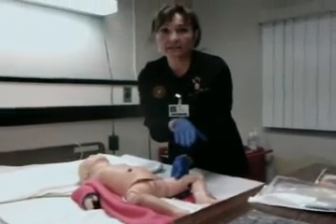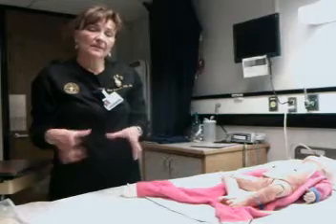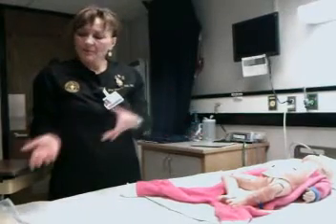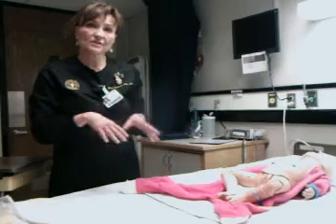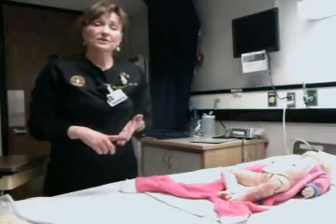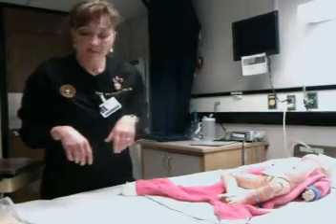Normally with little infants you may have to separate the labia to see the meatus. On the mannequin you can see everything clearly. Now we're going to show you the sterile supplies. The catheter kit comes with a procedure that mentions you can don non-sterile gloves and cleanse the labia, but if you're using the povidine iodine inside the sterile kit you're touching everything. We feel the best method is to wash the labia with warm soapy water and dry first, then come back in with your sterile field. You also need a gown or cover for protection and protective eyewear, which is highly recommended for your PPE.